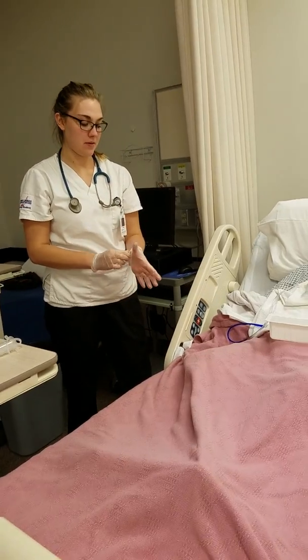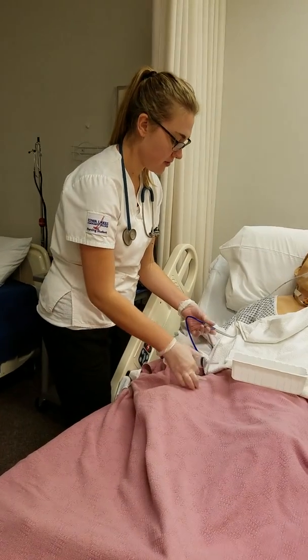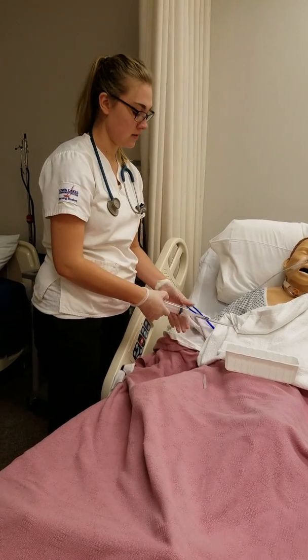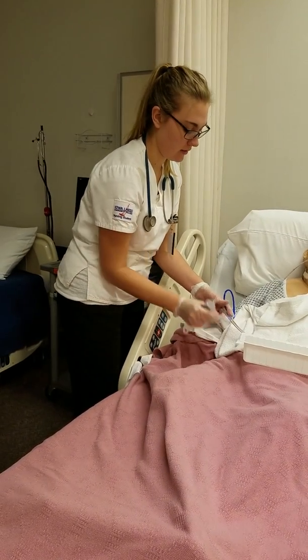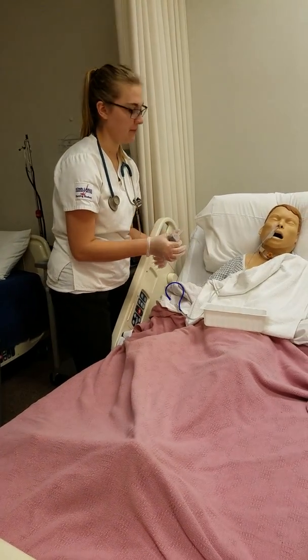Alright, and now I'm going to get a sample of the fluid. Are you doing okay? Okay, good. I'm going to do about 10 cc's of the fluid. Hooked back up because you're having any difficulty breathing. Okay.